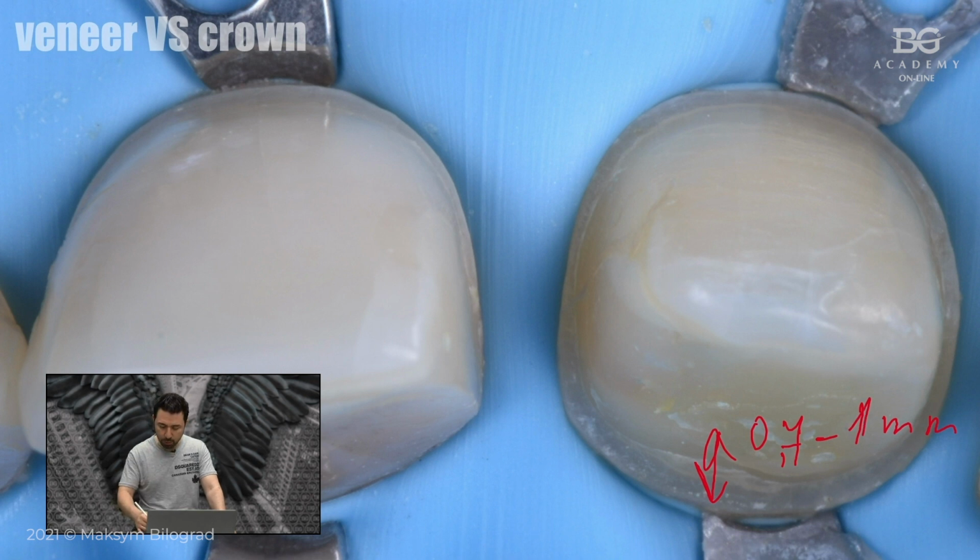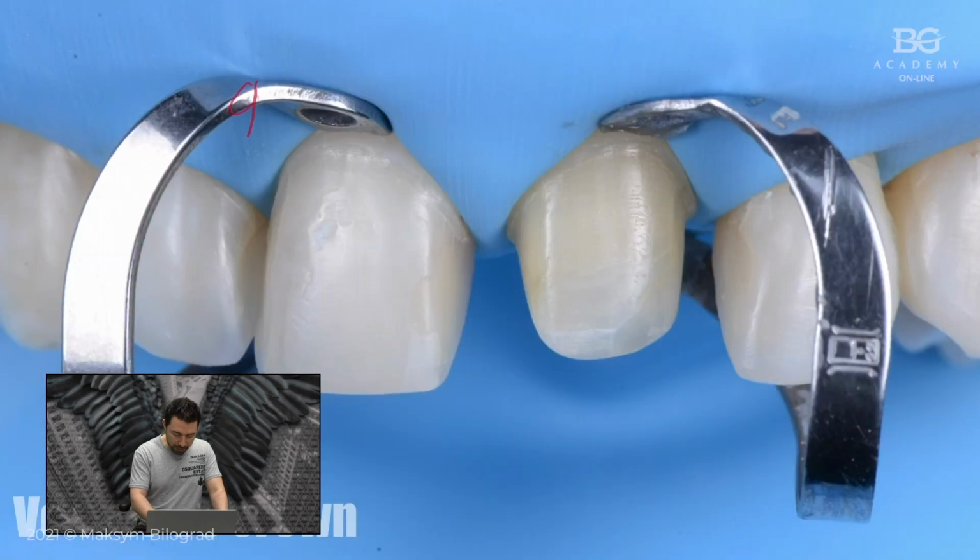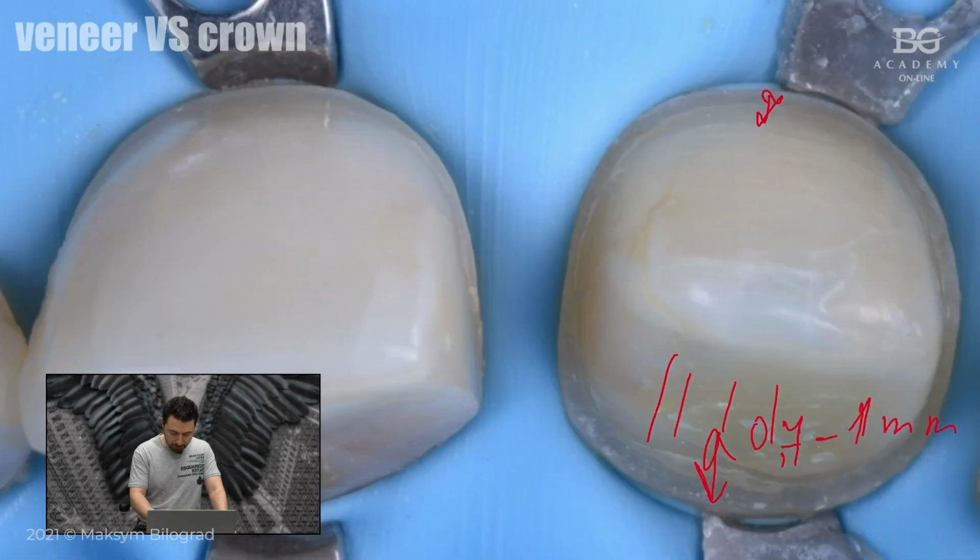That's why you can see that my finish line from the palatal side and the whole palatal aspect was prepared more than the vestibular. The vestibular margin is pretty much the same, but palatal is different.